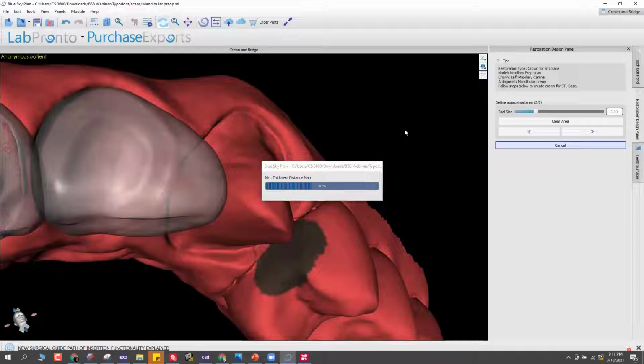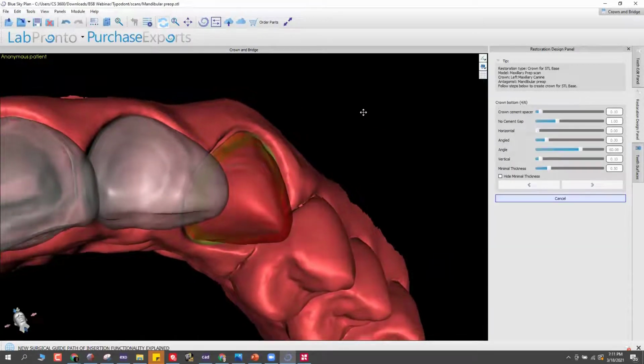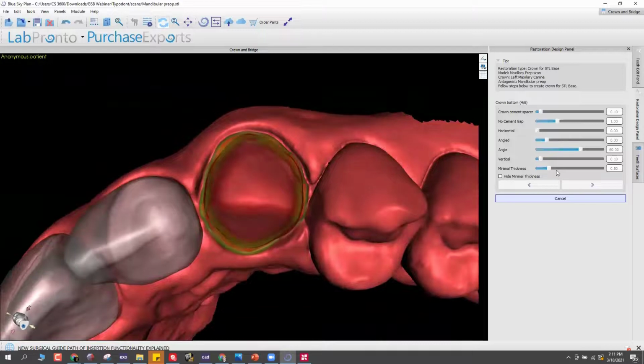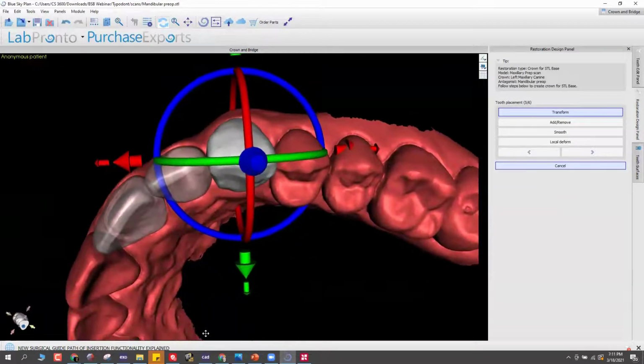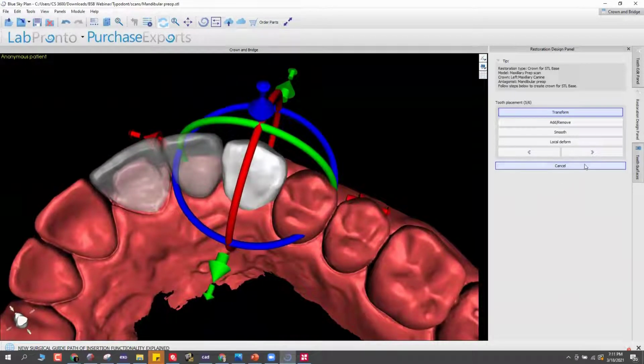Can you make a custom abutment? That also is on the development list. We actually have a development build for that. You could contact us and we could send that to you to hear your feedback. But that's not publicly released yet. That's still being worked on.